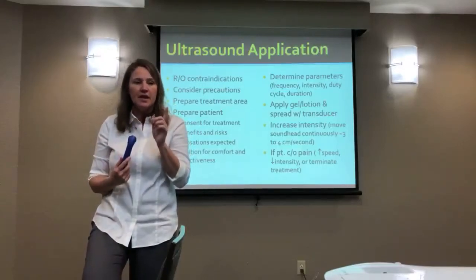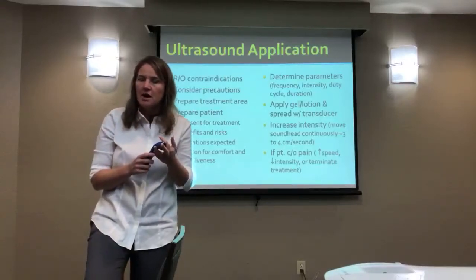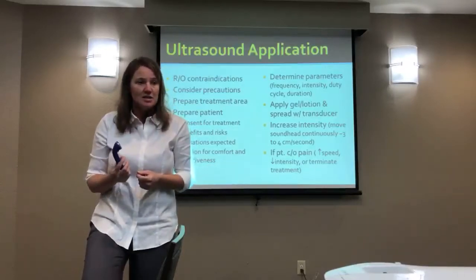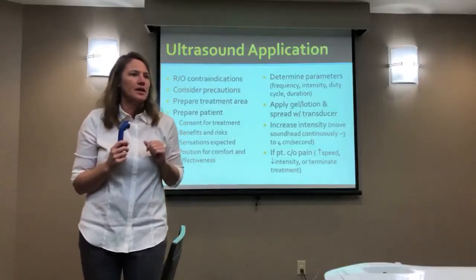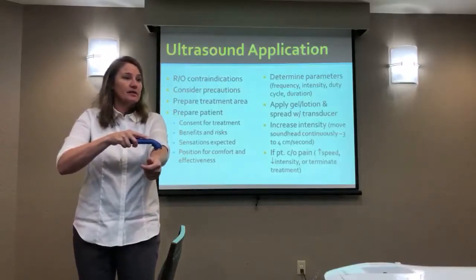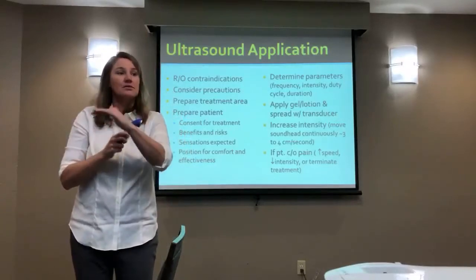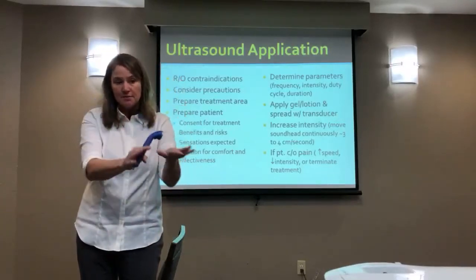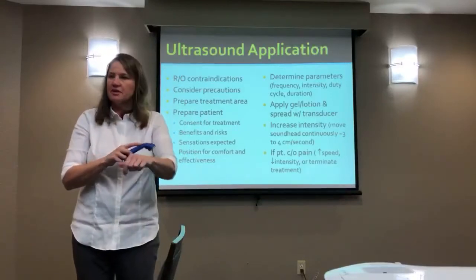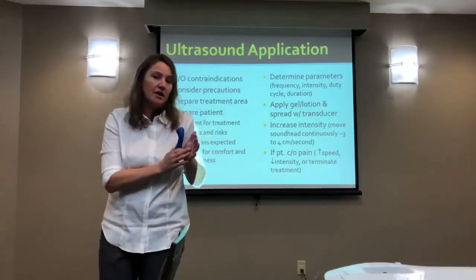Because the number one thing, we get all caught up with the intensity and the duty cycle and the frequency, but the number one thing, in my opinion, that affects the amount of heat being produced is your technique. So if I'm treating lateral epicondylosis, for example, and I'm going about twice the size of my sound head at this rate of speed, and then someone else does what they consider the same treatment, all the same setup on the machine, but they're going bigger and faster, they are not comparable. The outcome I would have gotten is not comparable to the outcome you would have gotten. How do you control for that?